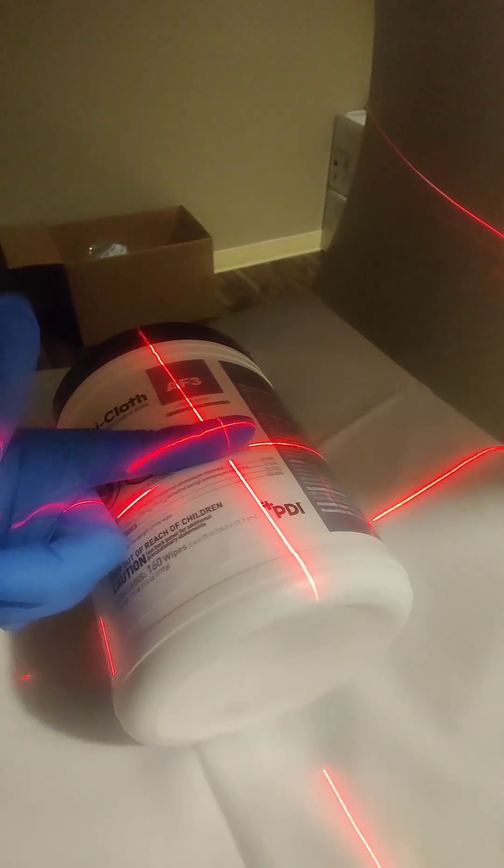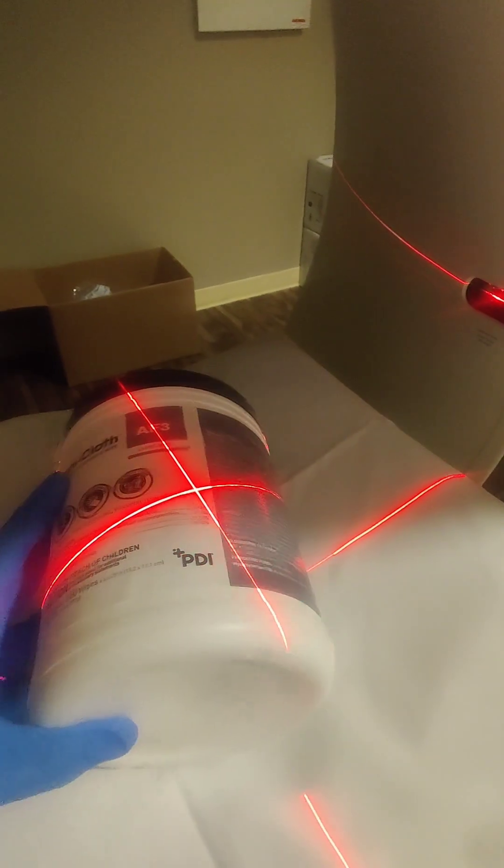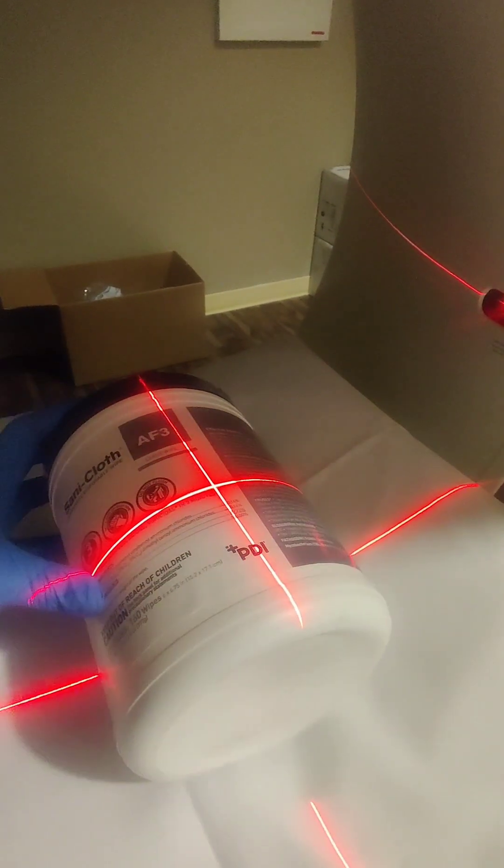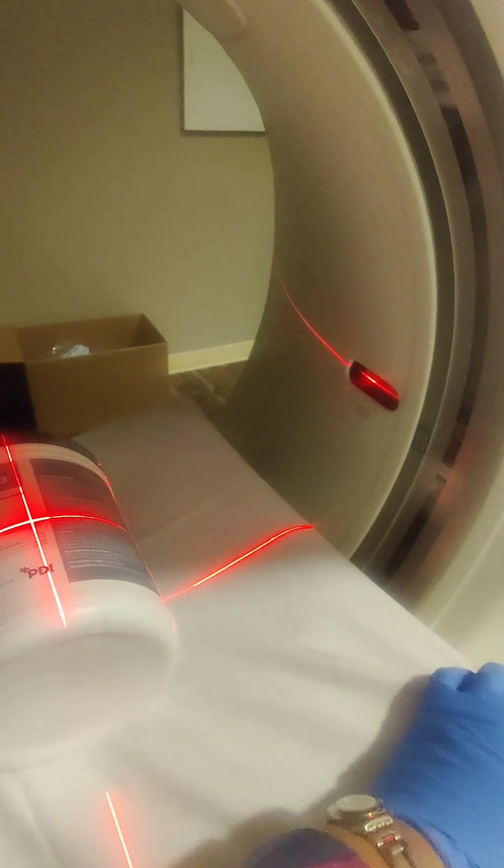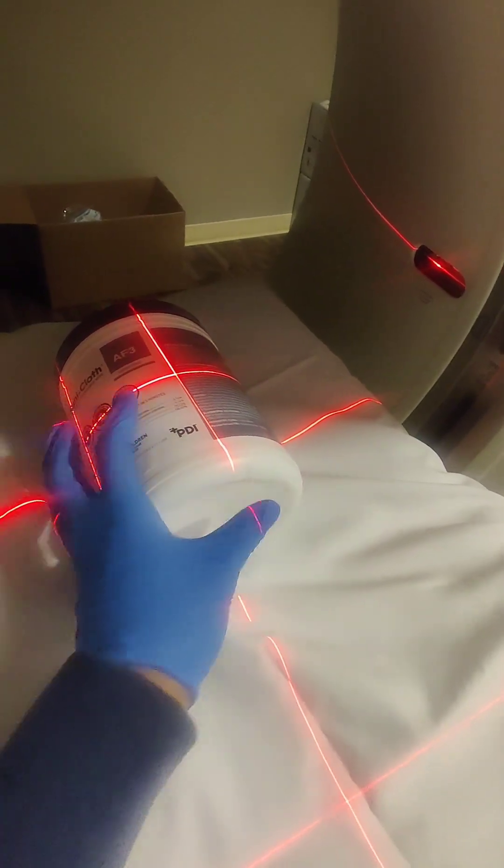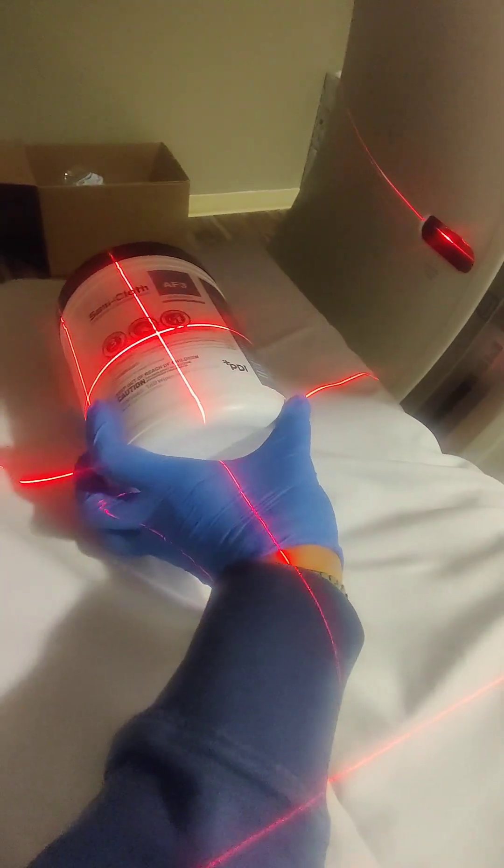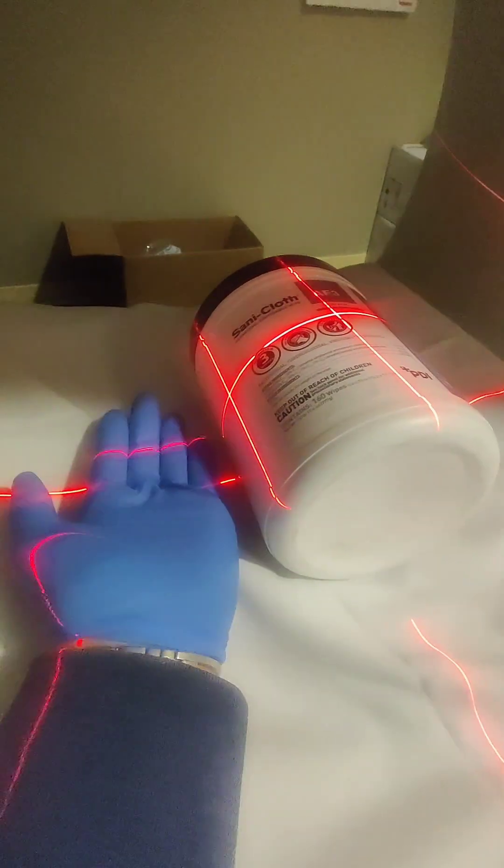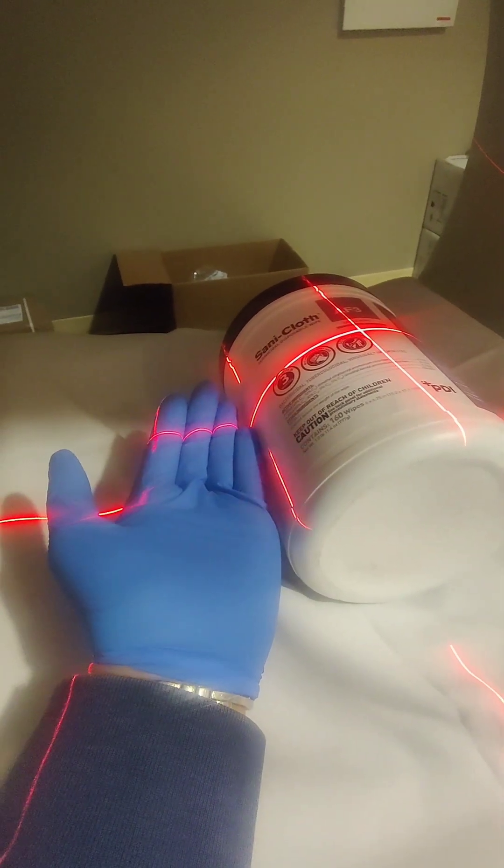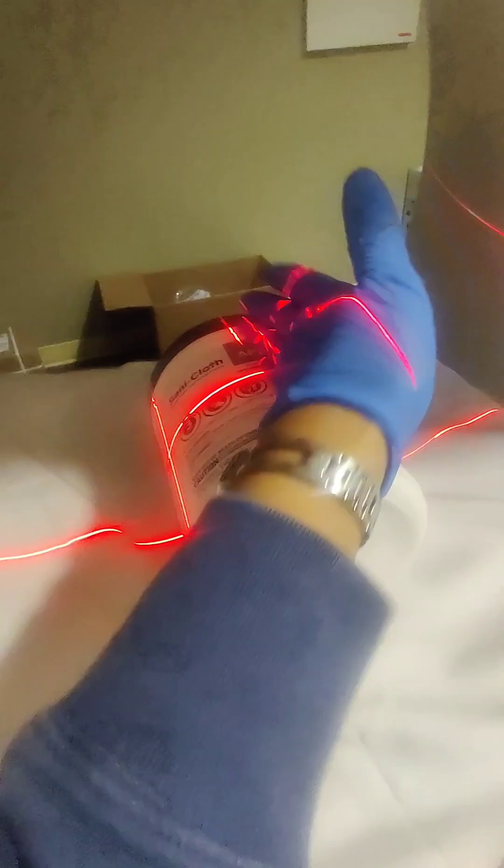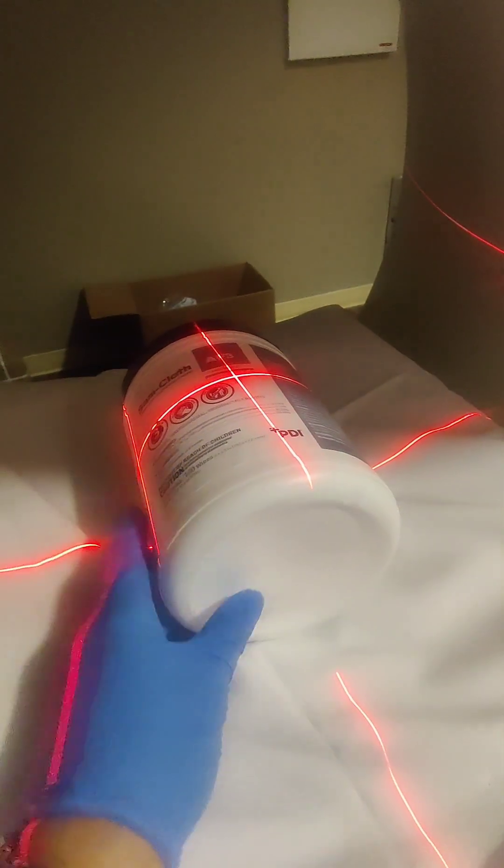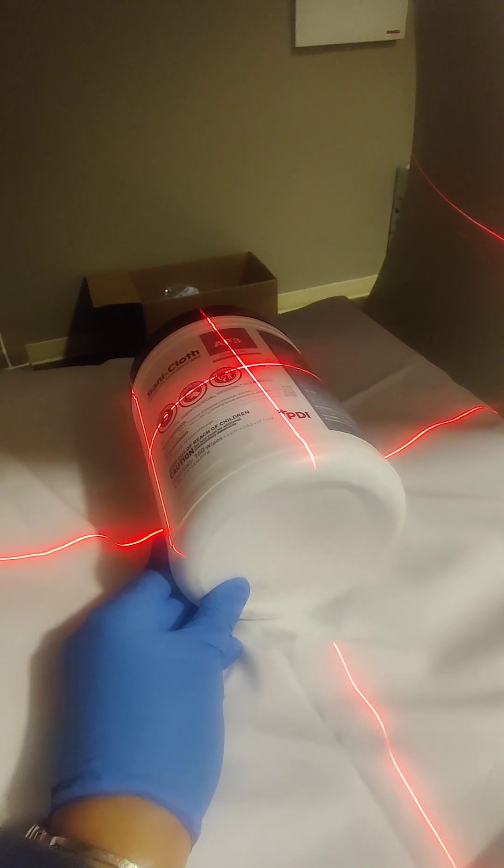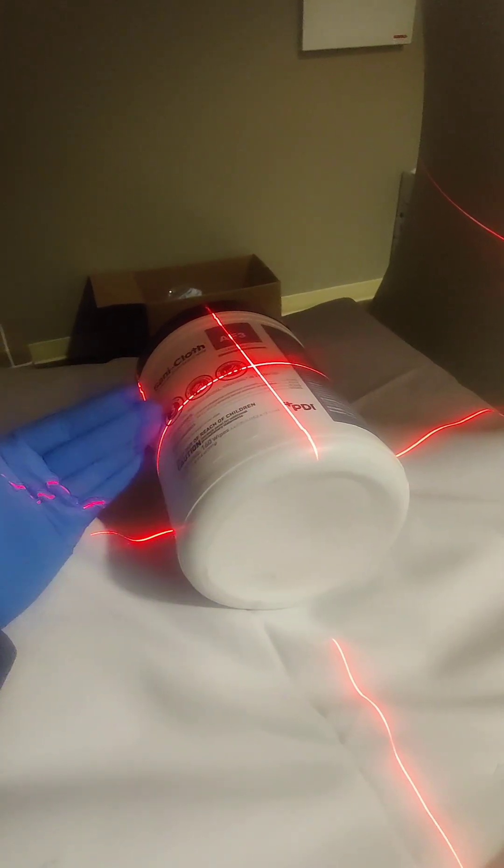This is a crosshair that needs to be centered. Let's say it's like tilted. You either want to try to tilt their head over. Sometimes it helps to just pull the sheets and move their shoulders over. So you move their shoulders by pulling the sheets. It'll straighten them up. So you want this straight. And then you want this at the center of the ear. And this lined up at the orbit and this lined up at the glabella, like mid-sagittal line. All straight. Everything needs to be straight and even. And then use your inside light.